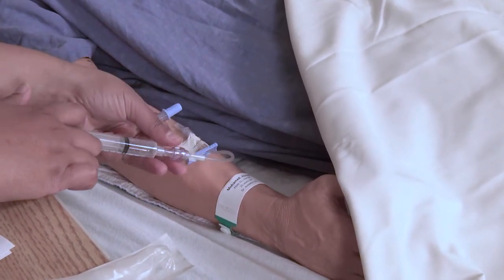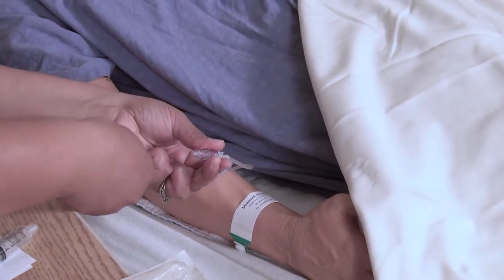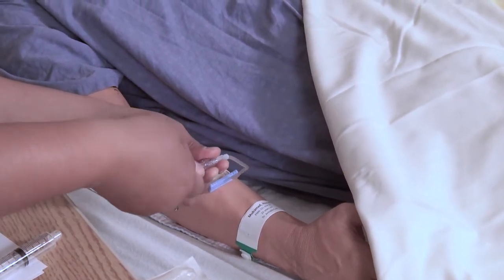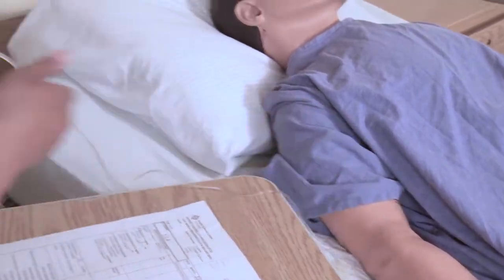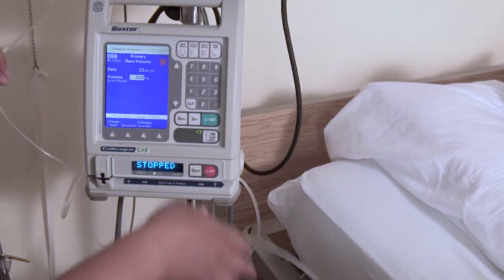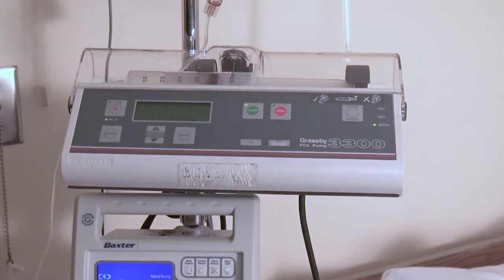So you would flush, and then we're going to attach the Y connector to the IV. So now you have your Y connector connected to the patient. We're going to open all of our clamps, and then we're going to start all of our pumps. And now it's running.